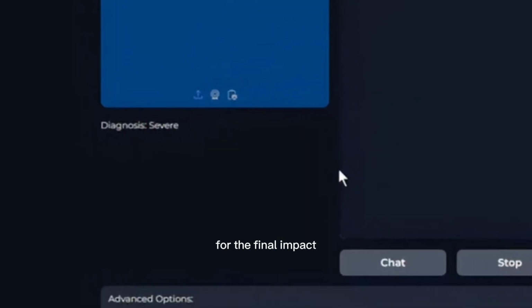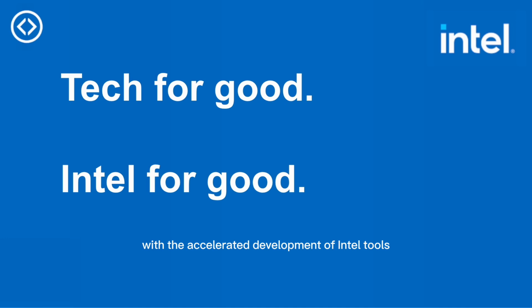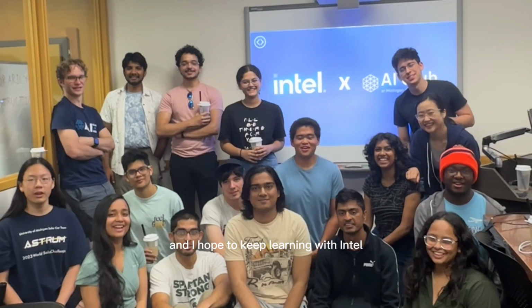For the final impact, there would be an expected 30% increase in early stage diabetic retinopathy detection, inference computation and operational costs would reduce, and accuracy and precision would improve by 10%. With the accelerated development of Intel tools, I hope that tech is going to be used for good. I had a great time learning in the AI PC program, and I hope to keep learning with Intel.